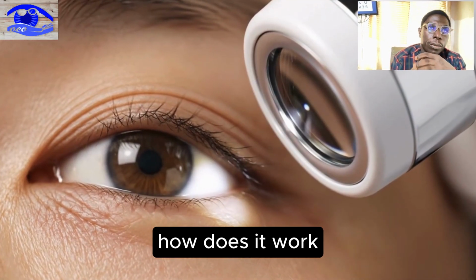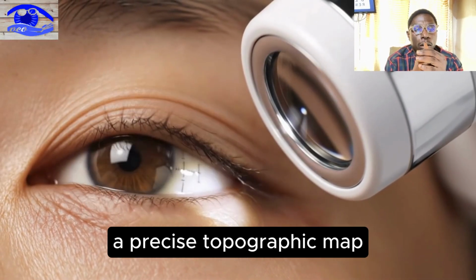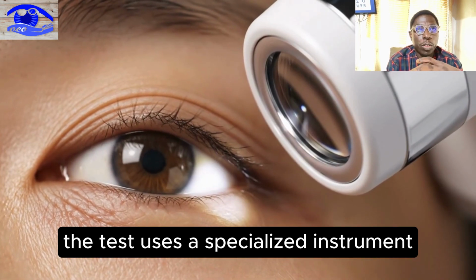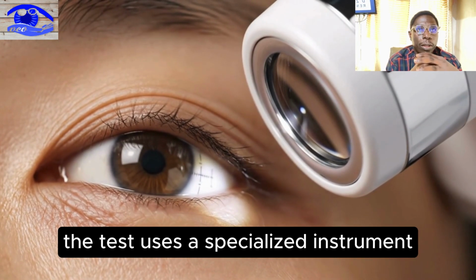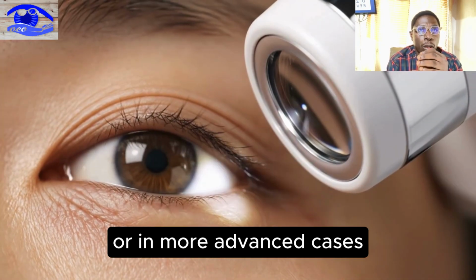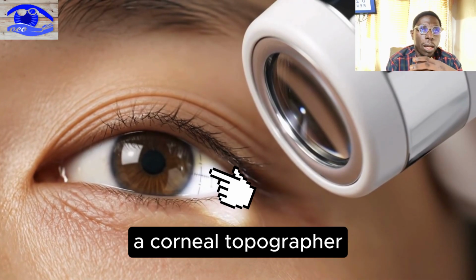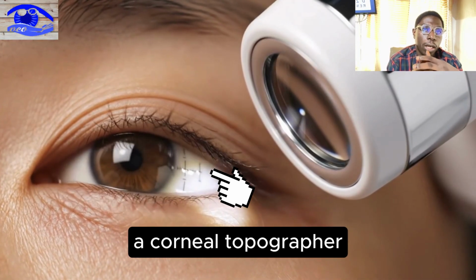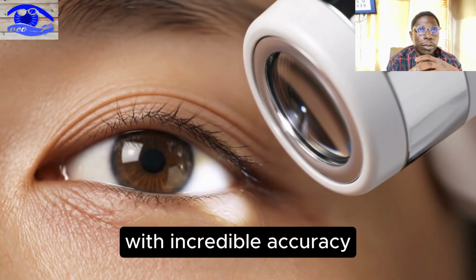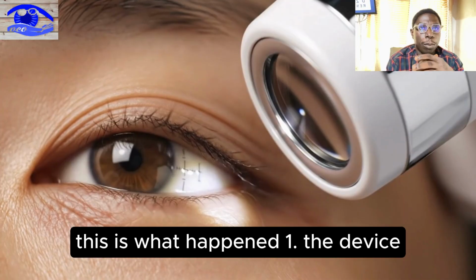How does it work? It's like giving your cornea a precise topographic map. The test uses a specialized instrument called a keratometer, or in more advanced cases, a corneal topographer, to measure the surface of your eye with incredible accuracy. This is what happens.